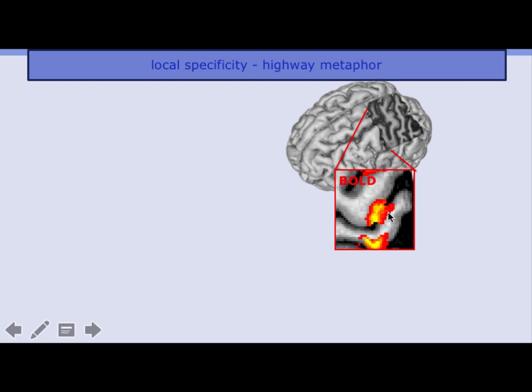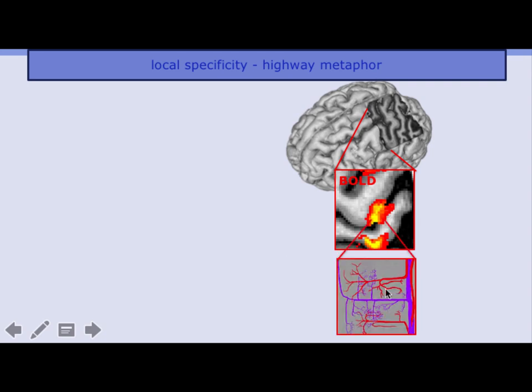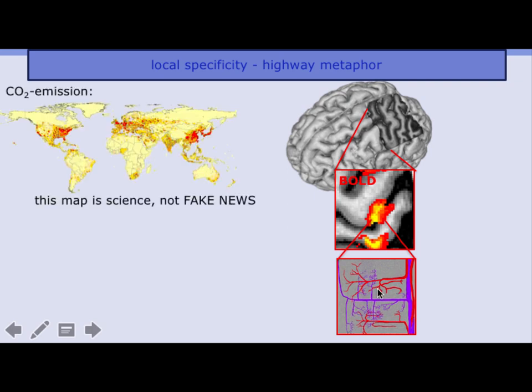And this feature is well explained since the advent of fMRI and comes from the fact that most of the BOLD signal changes refer to oxygenation changes within these large vessels that are not as nicely laminar aligned like the neurons are.